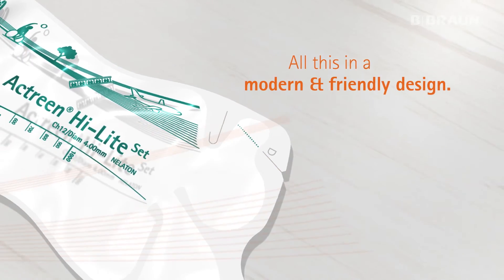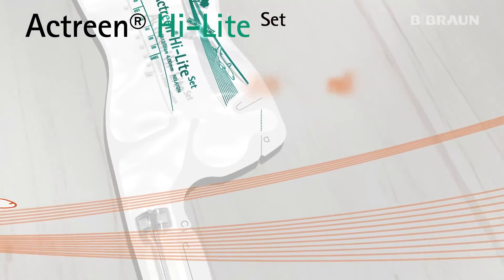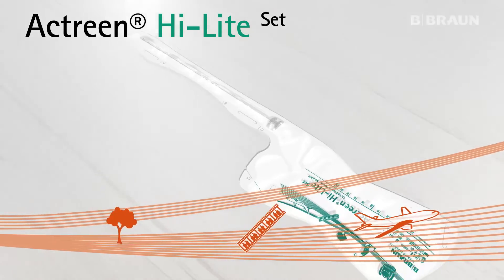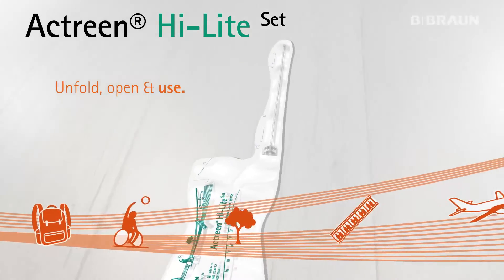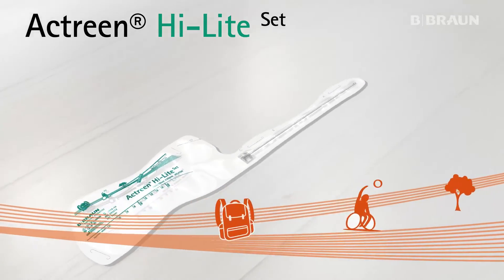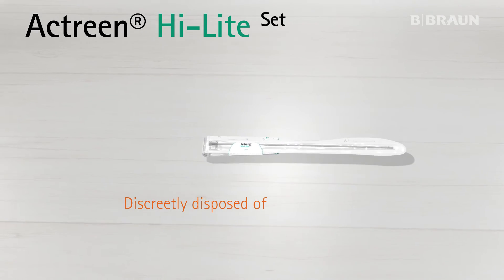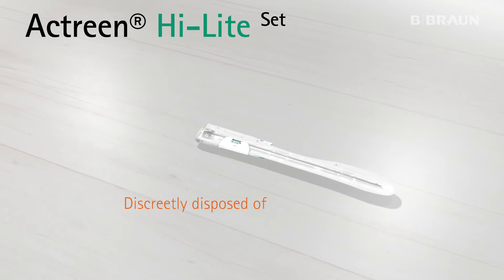All this in a modern and friendly design. Actreen Hi-Lite Set makes catheterization procedures shorter and easier than ever before: unfold, open and use. After use, the Actreen Hi-Lite Set can be refolded with a sticker and discreetly disposed of.